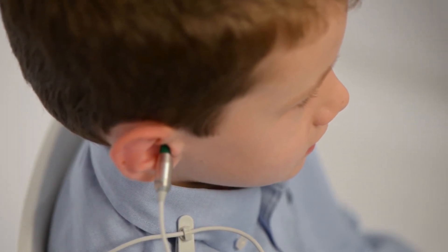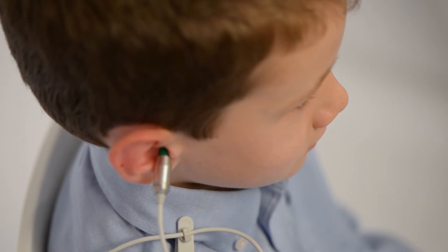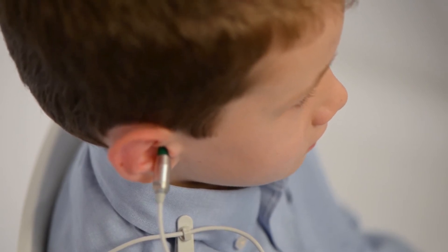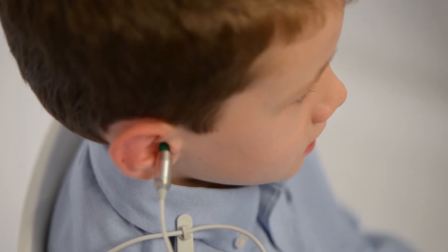Insert the probe in the direction of the nose and then turn it slightly back, pushing it into the ear canal with a slight twist. The probe should remain in the ear without being held during the test.